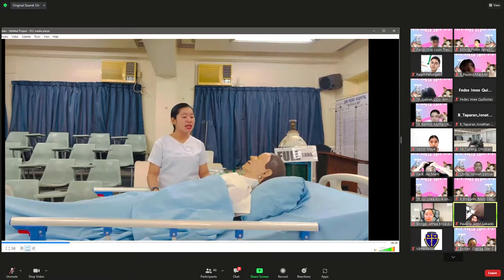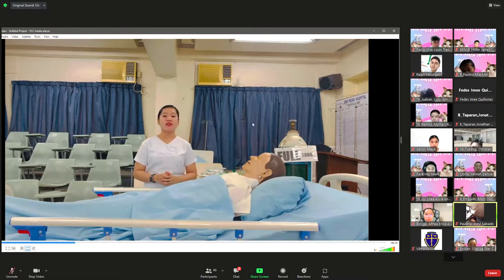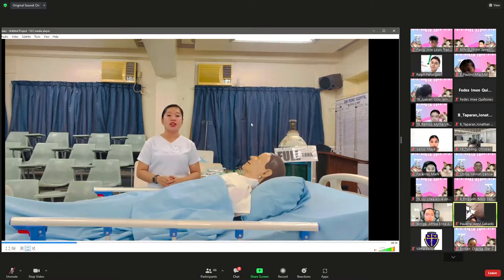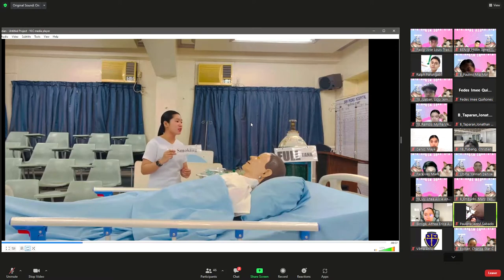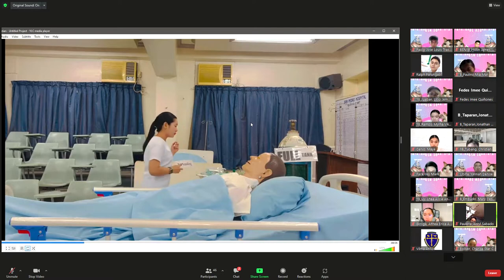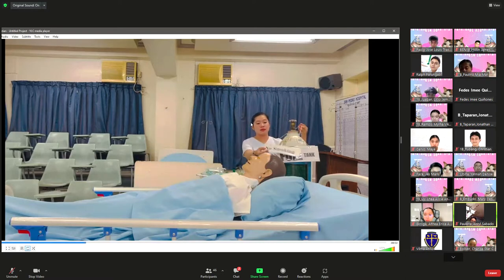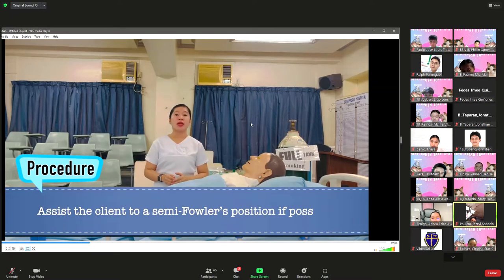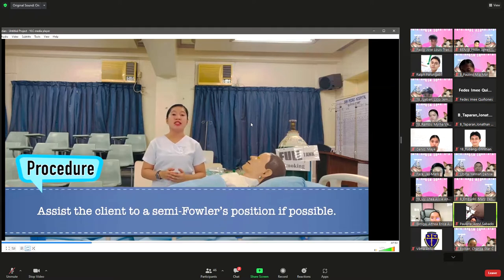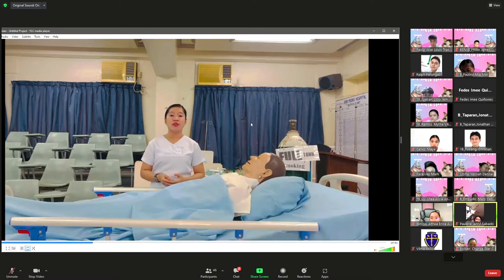Identify and explain the procedure to the client and review safety precautions when oxygen is in use. For example: 'Good afternoon, ma'am. I'm Nurse Sebastian. Based on my assessment earlier, your oxygen level is a bit low, so we need to give you oxygen therapy.' Explaining the procedure relieves apprehension and promotes cooperation. Do not forget to post the no-smoking sign, as oxygen is combustible. Assist the client to semi-Fowler's position to allow free movement of the diaphragm and promote chest expansion.